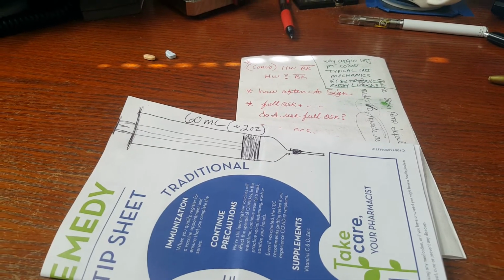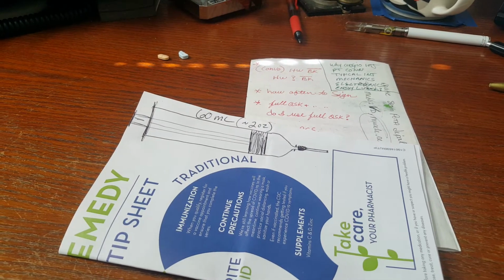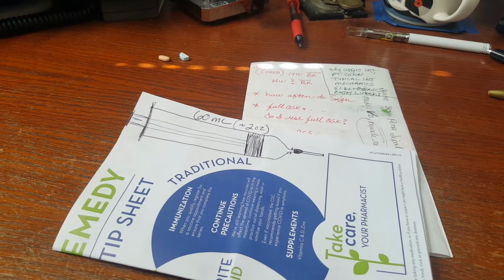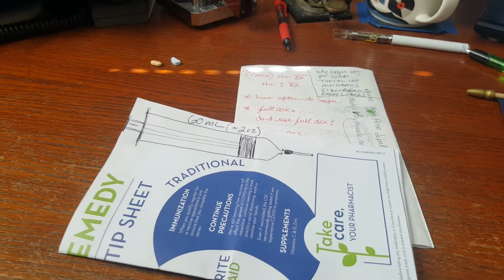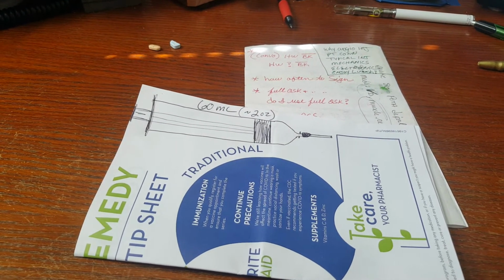And when they trigger that injection, that machine starts slow and it ramps up logarithmically, and you hear the stepper motor in it just start cranking. And you hear it straining under the stress of the pressure.